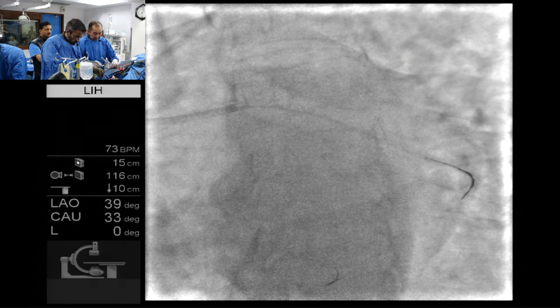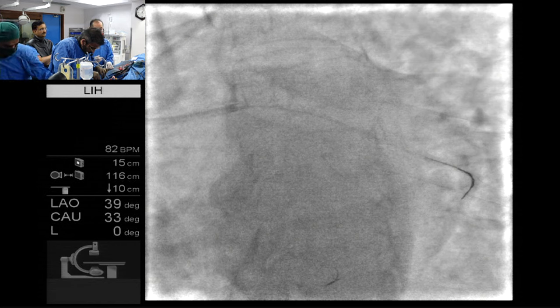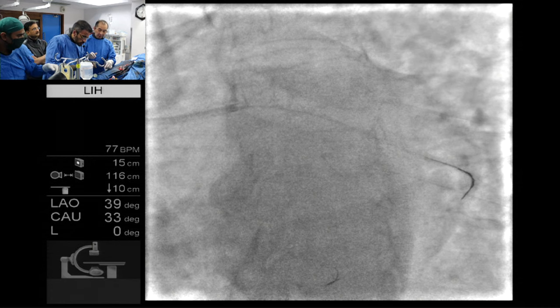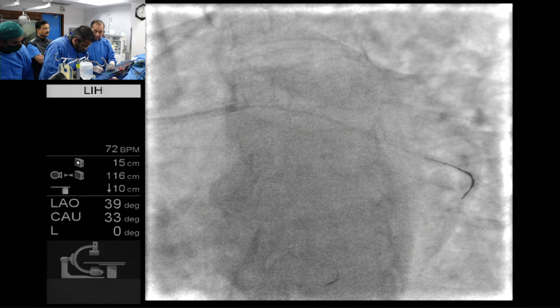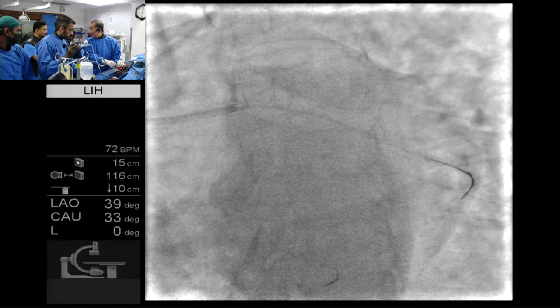So, any more tricks in the balloon non-cross? I think just anchor a little distally, not so close to the stent, and then be a little more persistent with the force with a 1 millimeter balloon. I think it may cross. Just a naive suggestion. This is a 1.5 balloon. So I think 1 millimeter might be good if this doesn't go. Yeah, 106 or 108, or 105. Whichever. We have Sapphires and they're 6 and 8, I think.